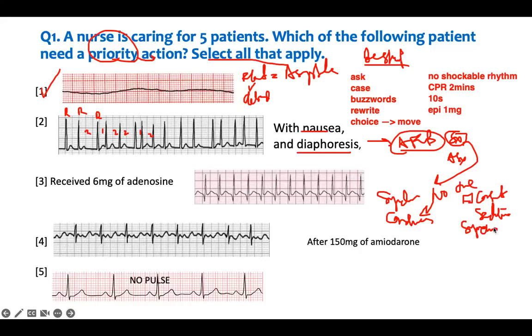That changes it from defibrillation to cardioversion. If you don't put the sync mode on, that is bad. That means you're going to kill the patient. So the sync mode has to be put on. Then you deliver about 50 to 200 joules to jumpstart the patient's heart. And that's what you do with AFib that is symptomatic.